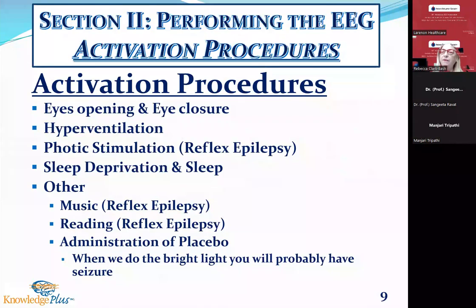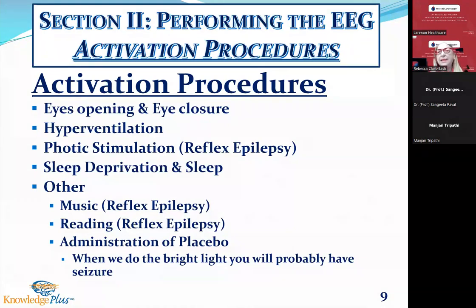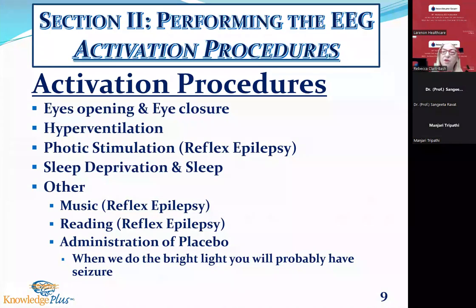Of course, in the very first 10 seconds of my EEG, I'm trying to assess what the dominant PDR is, and does that PDR correlate to normal age-specific expectations. So in the first 10 seconds, I'll use eye opening and eye closure to say to the physician, you know what? They are awake. As you can see, they open their eyes and they close their eyes, and then we get an improvement in the PDR.